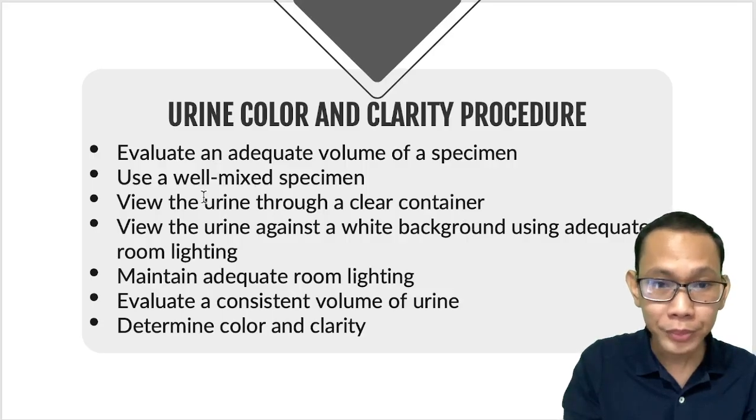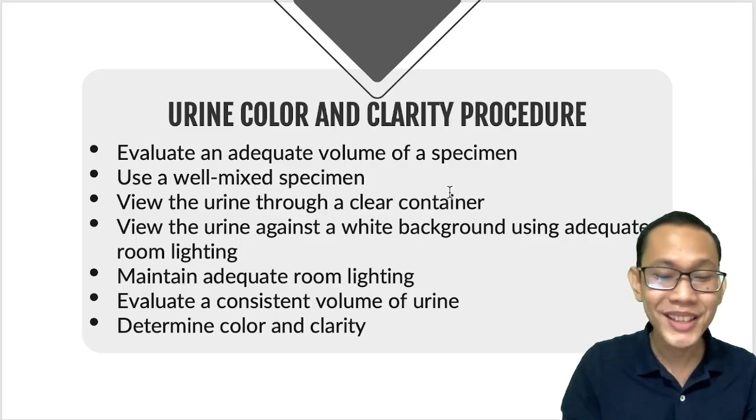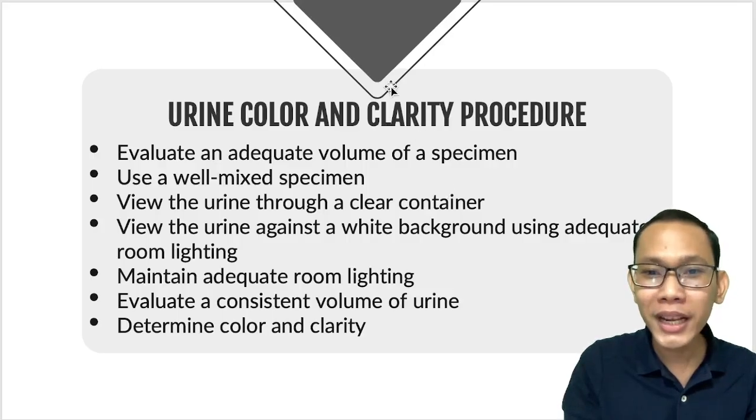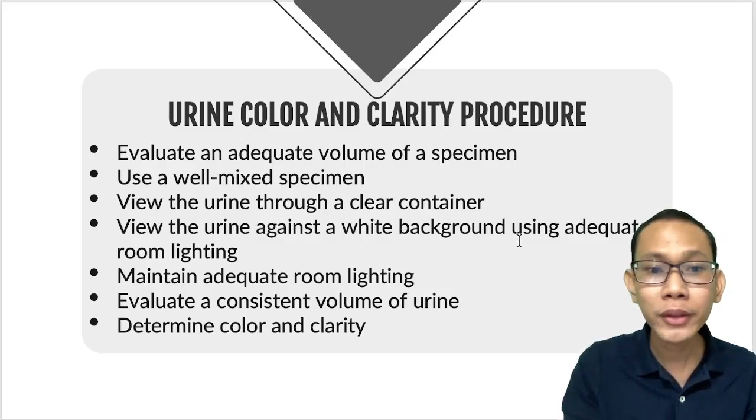Okay? Next, view the urine through a clear container. Of course, that's very important, no? Kung imong container turbid na daan, of course, you will be able to give an incorrect clarity na result. View the urine against a white background using adequate room lighting. So this is the most ideal thing to do.